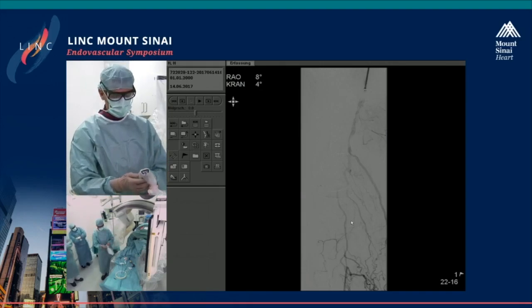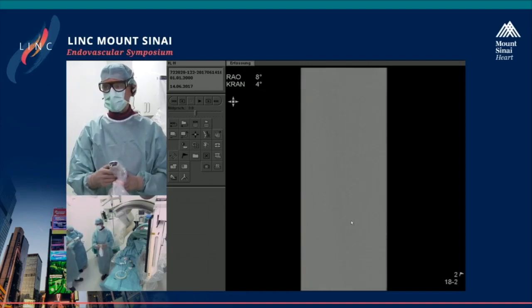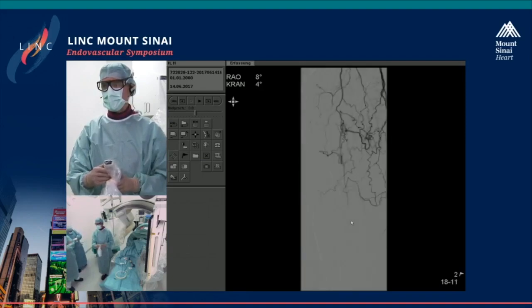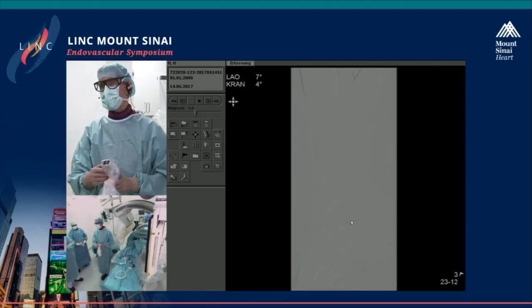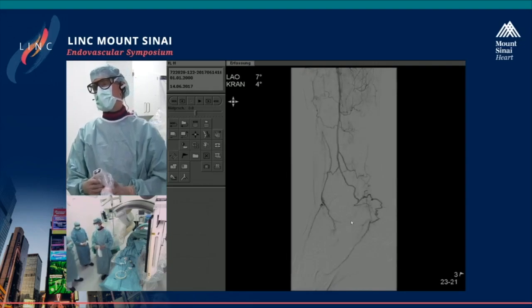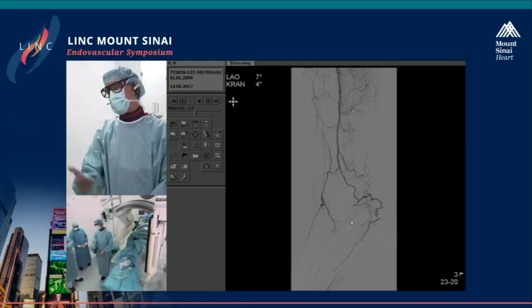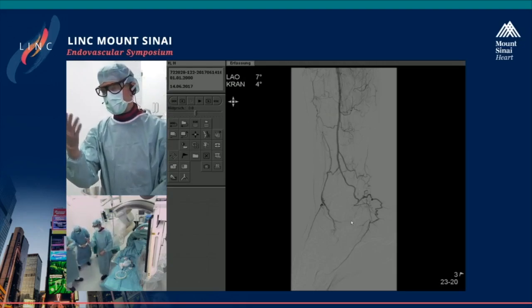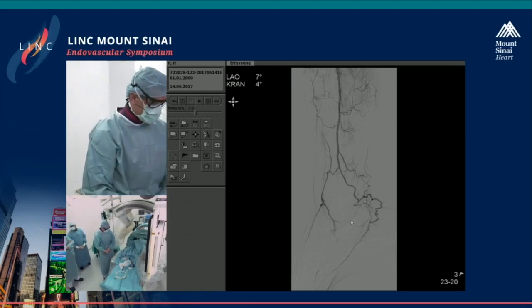The patient is feeling already better, but to assist what has been done to the SFA and popliteal artery, we clearly need to open up this segment. You can see the peroneal artery going down. So in fact, it's a distal popliteal occlusion, and a very nice case to approach from retrograde. Of course, you can try to puncture what's left from the dorsalis pedis, but clearly we would puncture the peroneal artery now. That's what we want to show.